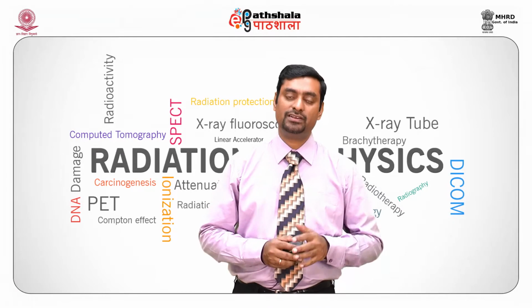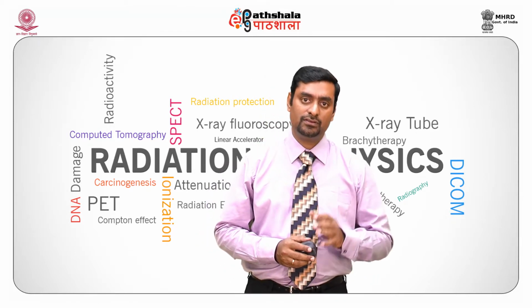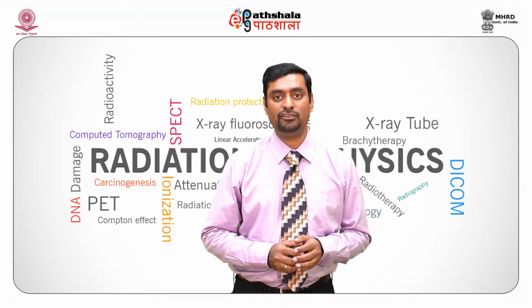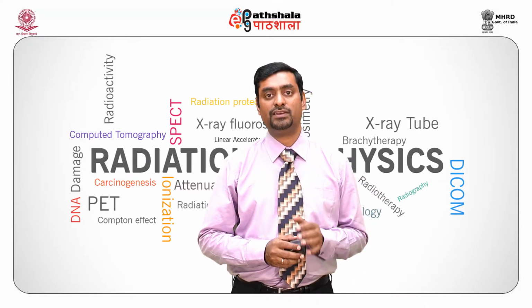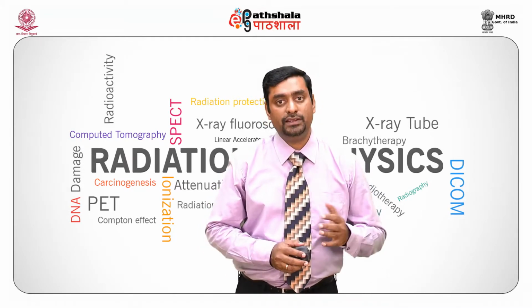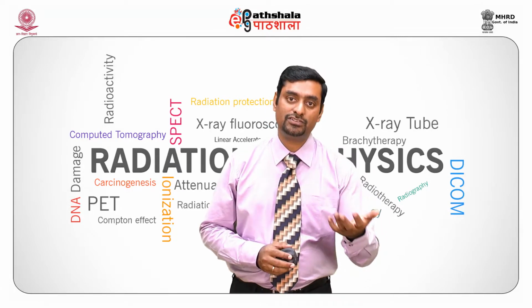When films are used directly, they have high spatial resolution. So, in case of getting high spatial resolution, it is important to manufacture a detector which can directly convert X-rays to an image. In the indirect method, X-rays have to convert to light and light into electrons.